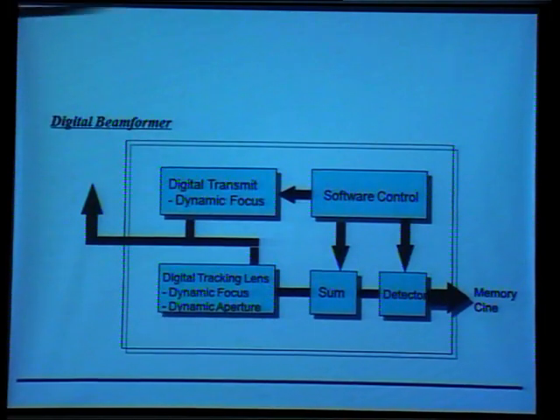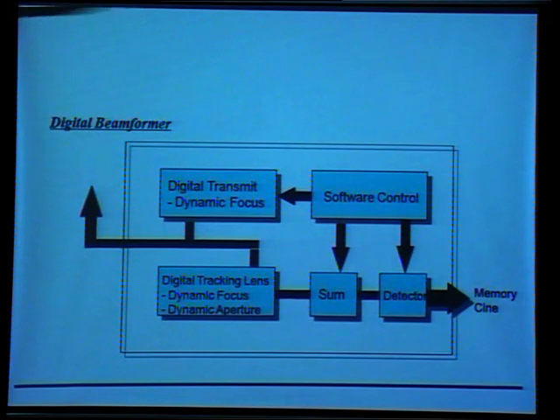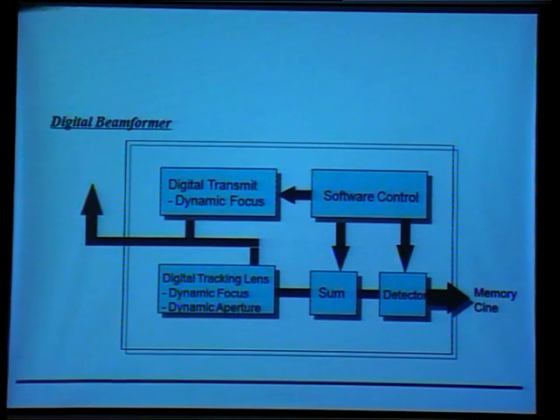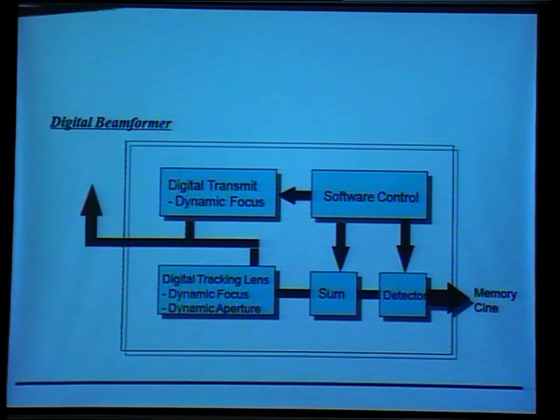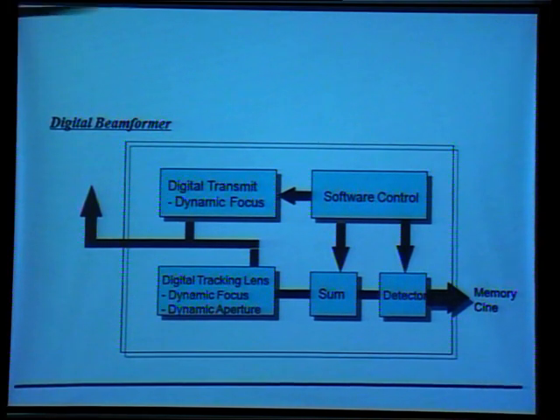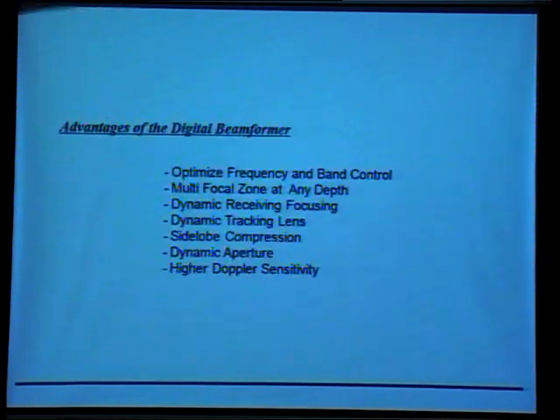Let's go. And this is something which is inside your equipment, which is responsible for converting, processing and taking all those images back to your monitor. These days, most of the companies have very advanced level of digital beamformers, very small and smart ones. You see these days, the iPhones, the iPads. That's where the technology is shrinking and moving in.